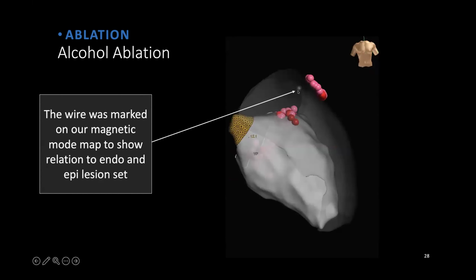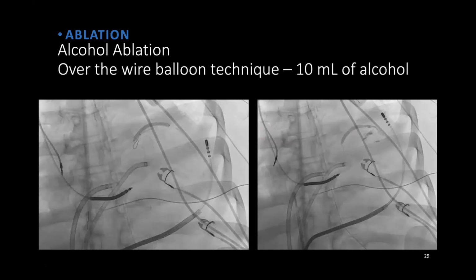So with a wire, we were able to find where these interesting signals are and annotate them in our mapping system. This is what I'm marking here. So yes, that's something that is worth following or doing. This is the configuration we did.